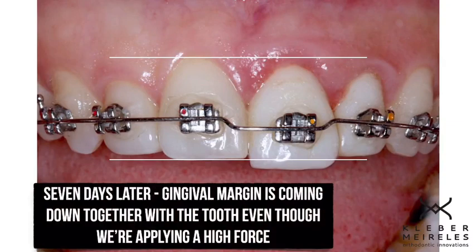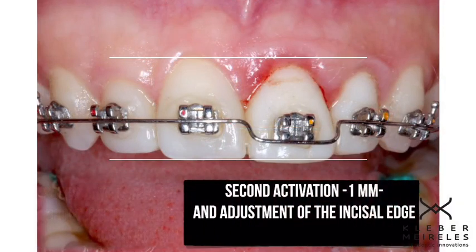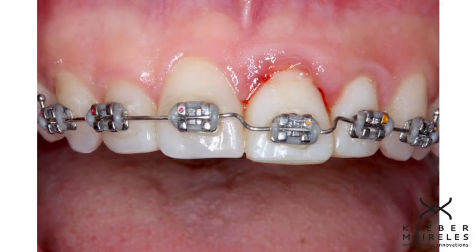So this is the first bend, and after a week I'll do another one millimeter bend. So I don't allow the periodontal ligament to follow the movement. This is what I want in this type of extrusion.